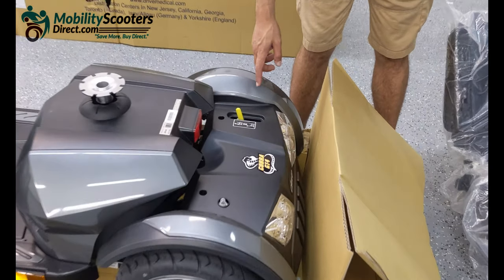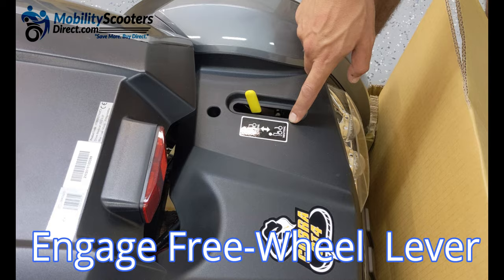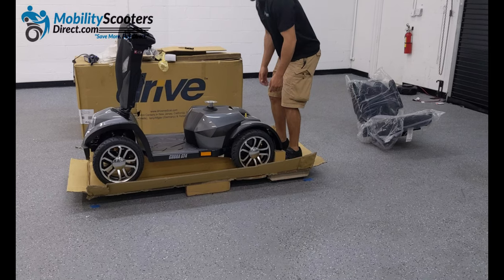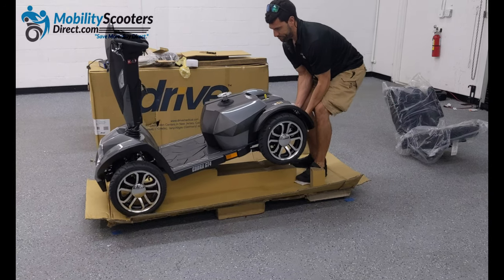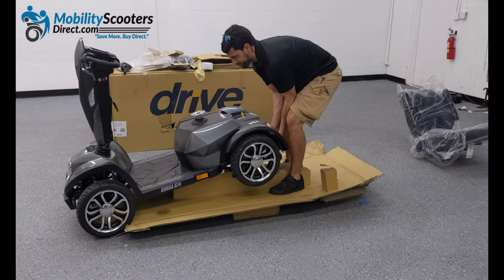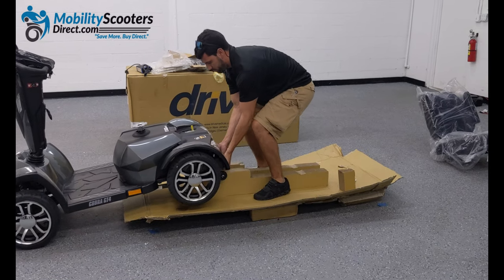Towards the rear you will need to disengage the automatic braking system. The freewheel lever is located in the back right. Pull it towards the rear to disengage the brakes — this will allow you to roll the unit off of the pallet. Carefully raise the back of the scooter, preferably with two people, and wheel it off of the pallet.